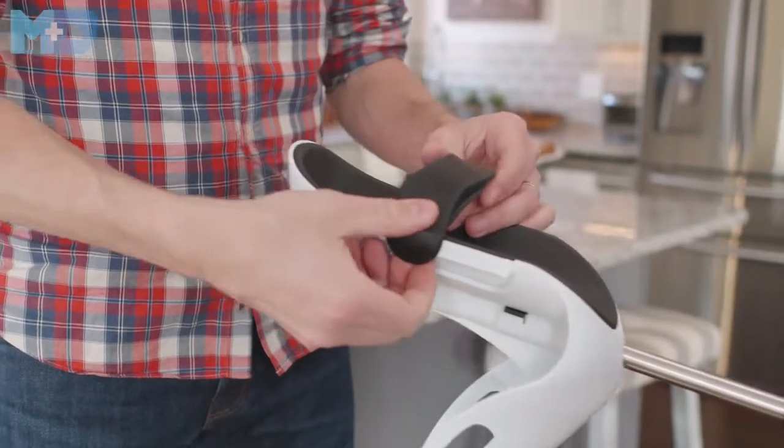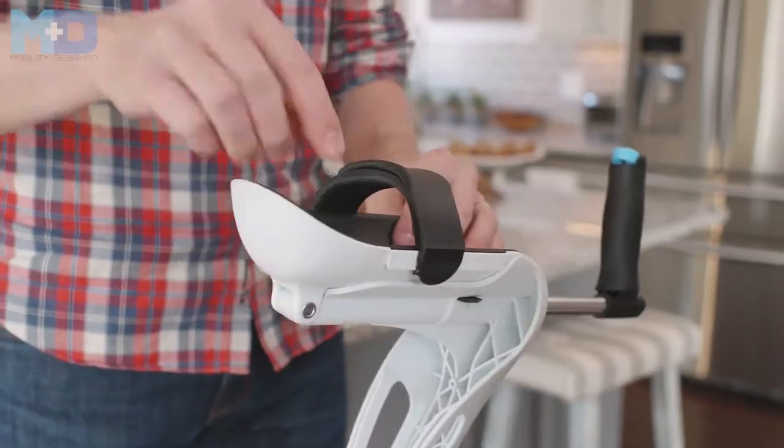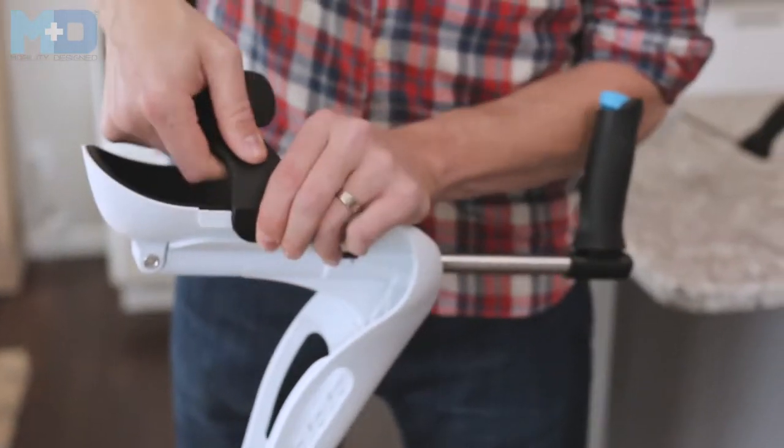You want to make sure that your armband's curve matches the profile of your arm. You would not want to flip your armband around backwards because it causes friction on your arm.